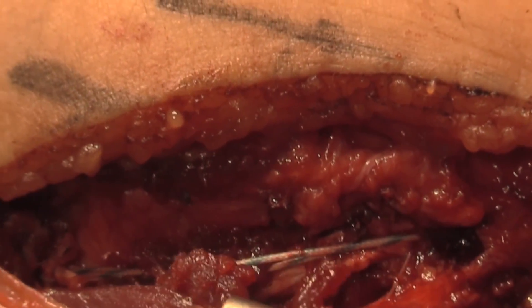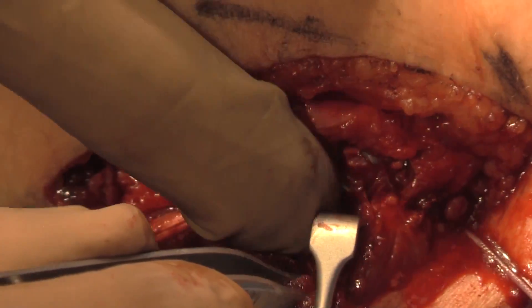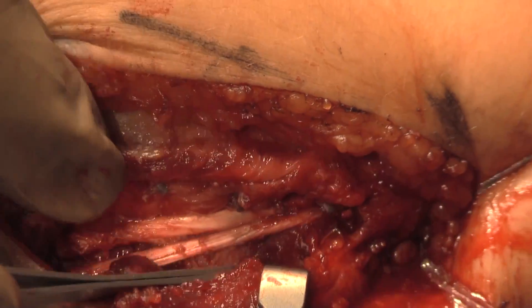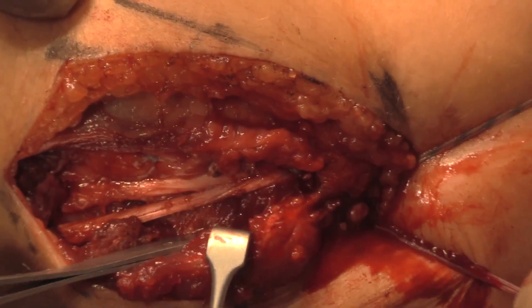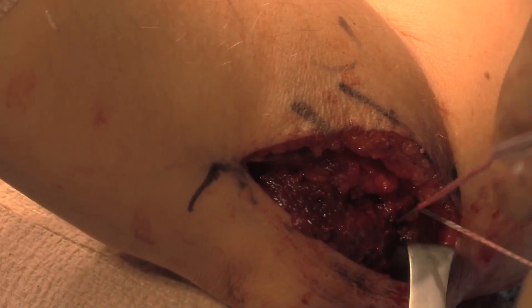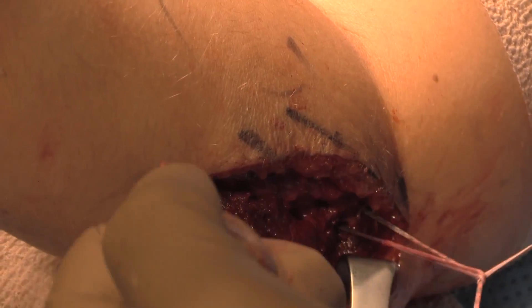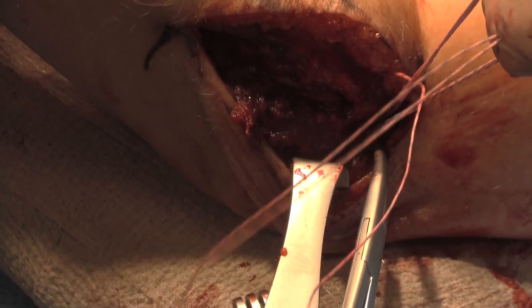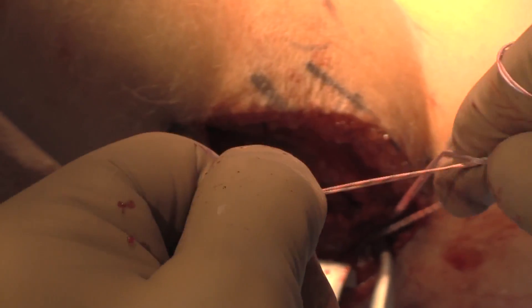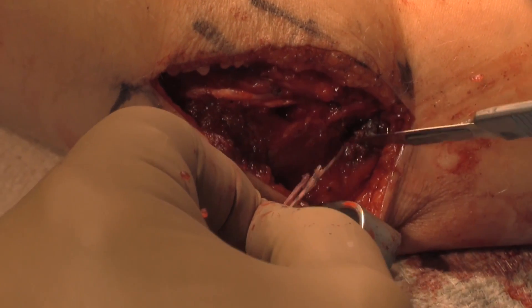At this point, as can be seen here, the graft limb is brought up into the tunnel and docked. The arm is taken through a range of motion to ascertain appropriate tension on the graft, as well as determining isometry and whether there is excessive graft motion. The sutures are then tied with the arm at 60 degrees of flexion, with the arm pronated and with a valgus force. Here is seen the final construct.